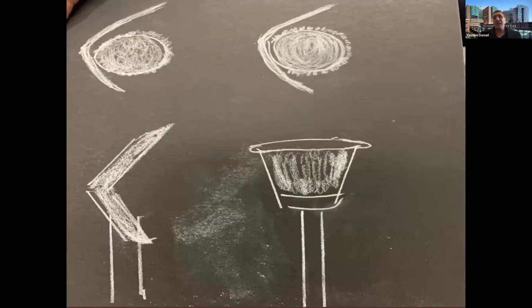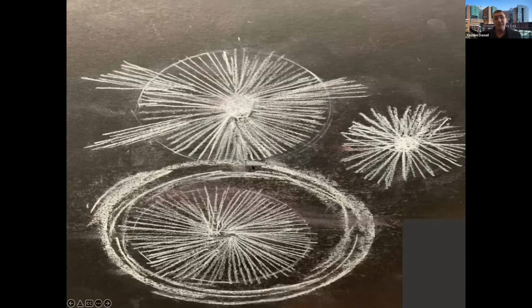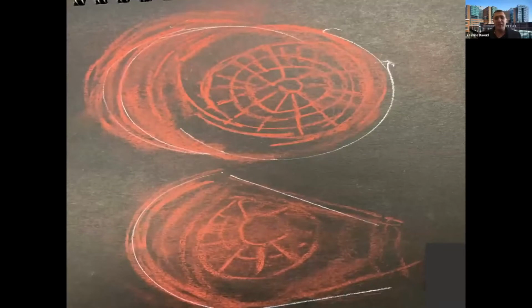This is a patient that I put a lens in myself, and you can see that in his regular eye, he's seeing lights like this, and this is his multifocal lens right here. When he looks at tail lights, this is headlights, you see that he sees a little bit of starburst, but this is what he sees in the multifocal lens. This is the starburst and the halos. He's an artist, so he was able to draw this: headlight, tail lights, brakes. So you can see that these things are real. These things affect patients' lives, and we have to be cognizant of that.